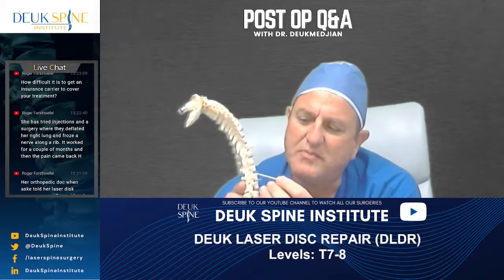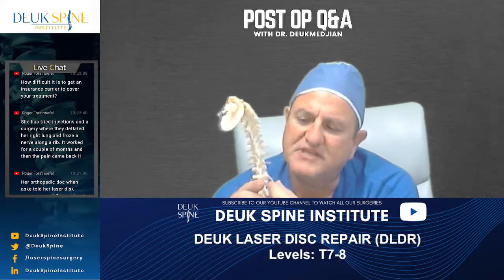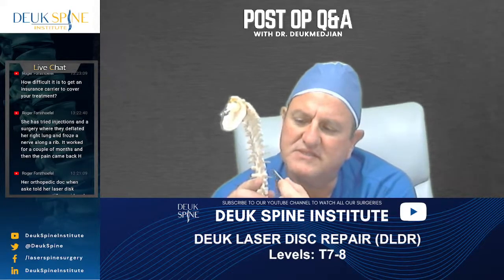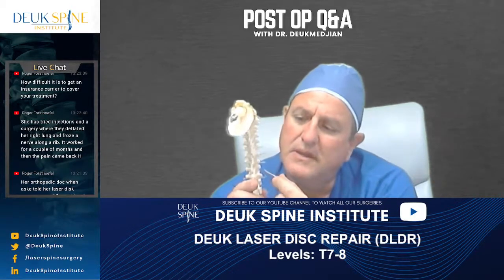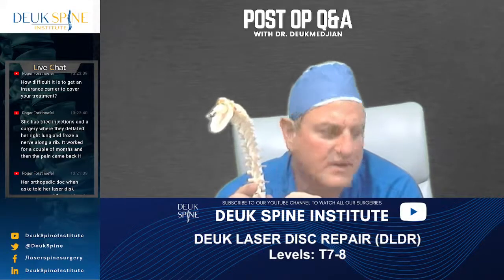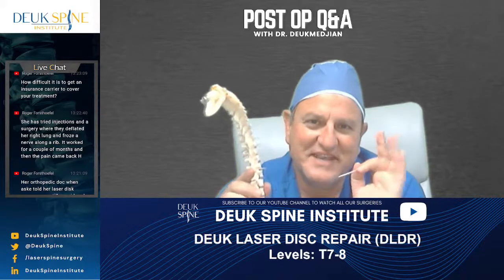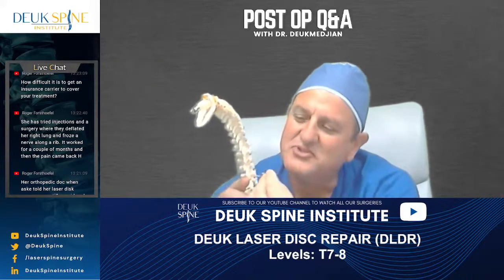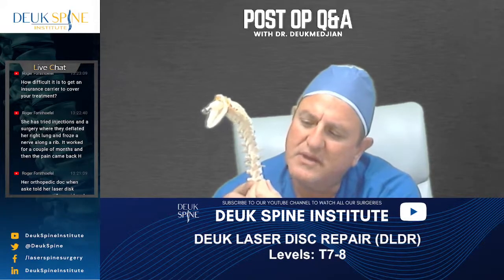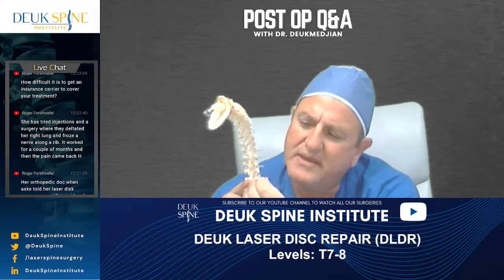Let's just say this is where the problem was right there. I came from the back. I touched the facet joint just so I stayed medial. I didn't want to come over here because that's a no man's land and no woman's land and no LGBTQ land and, you know, everything else that goes along with it, right? I mean, I'll just say no person's land. This is no person's land over here. So you want to hug the facet. You want to get into that disc injury right in the back here, right where the tear is. And that's what I did.